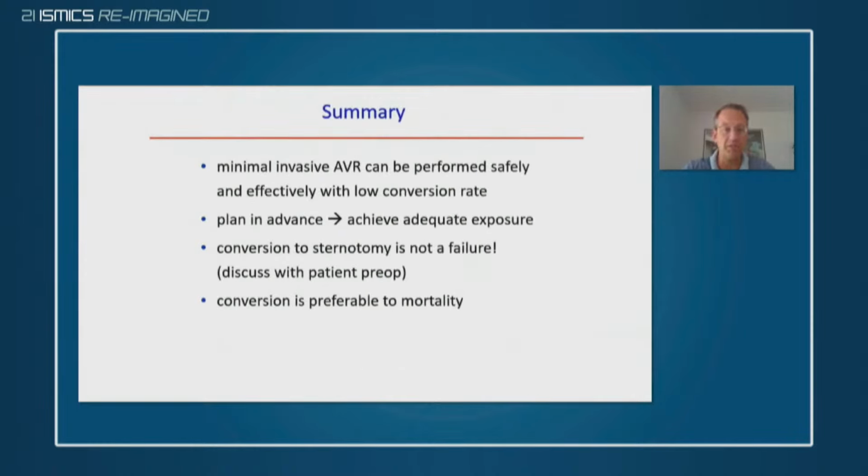So in summary, minimally invasive aortic valve replacement can be performed safely and effectively with a low conversion rate. We suggest planning in advance to achieve adequate exposure. Conversion to sternotomy is not necessarily a failure and should be discussed with the patients preoperatively, and is certainly preferable to a mortality. Thank you very much.